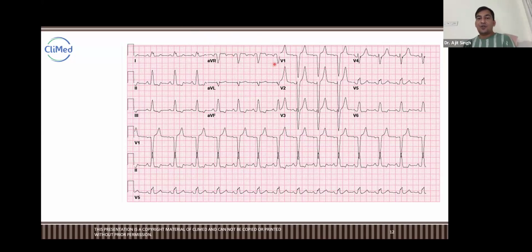If you're not able to look in V1, look here, in lead 1. It is a clear M, guys. It is starting with M. Look in 1, M, here. Can't you see this? This is M, and ending at W. See here, W, W, W. This is W here. Come on, guys. How can you not understand after this also?